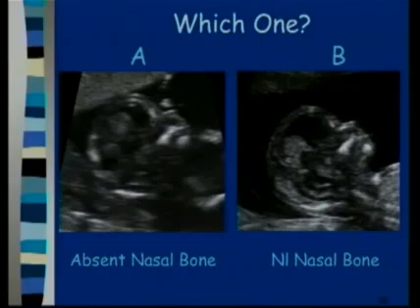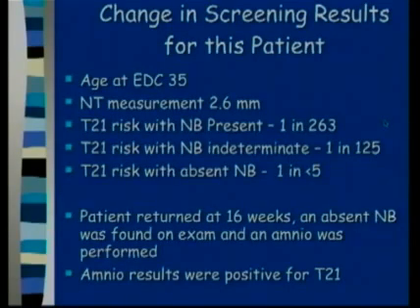So look at this region. This is just the skin. That is not the nasal bone. This is the nasal bone behind the skin. And notice that there's a normal tip at the end. So this just changes the screening results significantly.